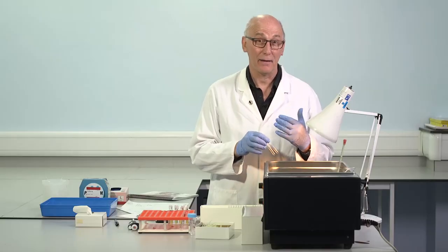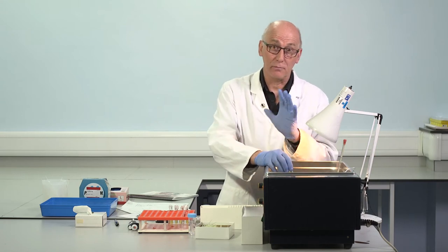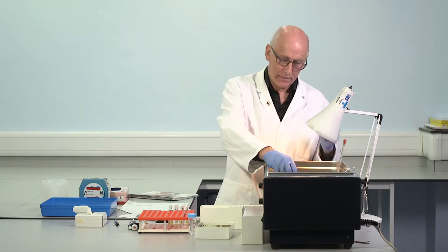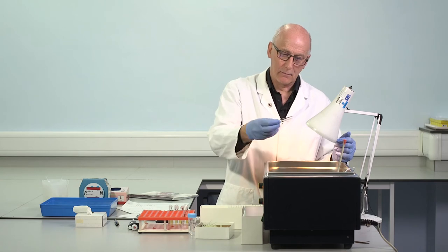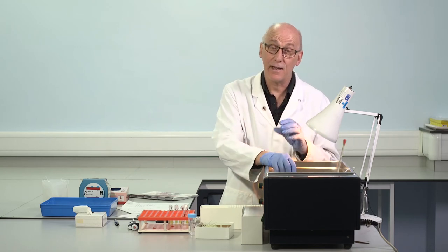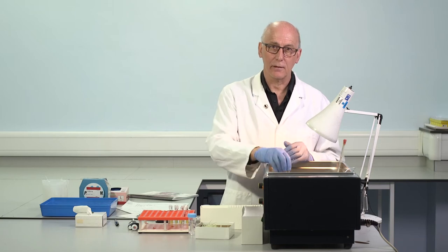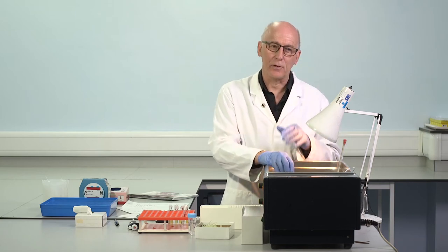It sounds rather quick, but actually it's not. These two tubes are empty, but just to illustrate. One. Two, three. That's the kind of frequency. It's not this quick. And why is it that frequency?